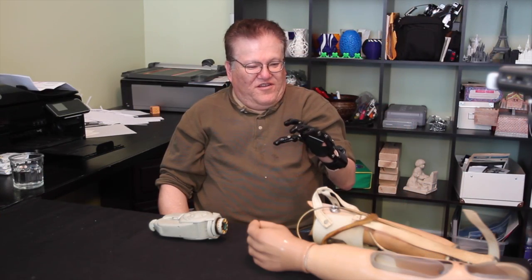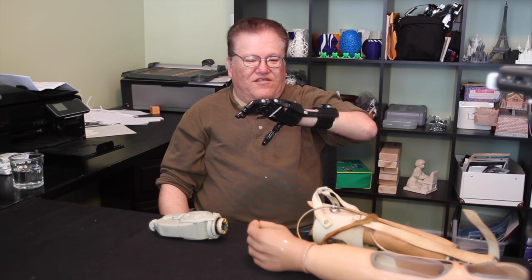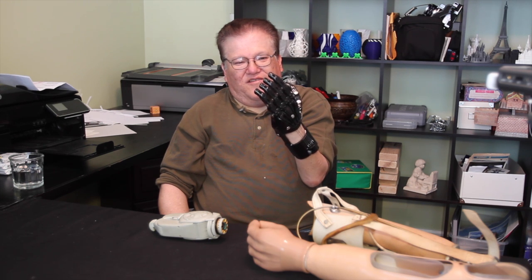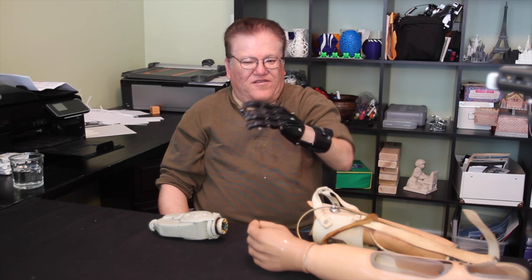So this is printed in ABS plastic, a very common 3D printing material. The shininess is because it's been treated with acetone vapor to give it a nice surface finish. The rest of the materials are readily available — just some hardware to assemble, some cords, a little foam padding and Velcro, and some other stuff like that.